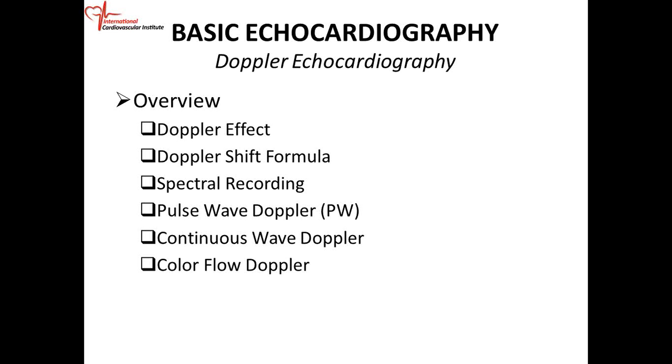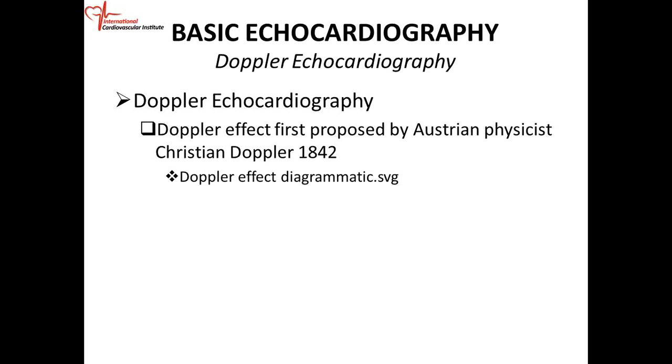And not only that, there's something we call shunt flow. That is how much blood is shunted across the defect. You can use Doppler to do that. So Doppler is extremely important, and you should try your level best to understand. It's not difficult. Okay. All right.